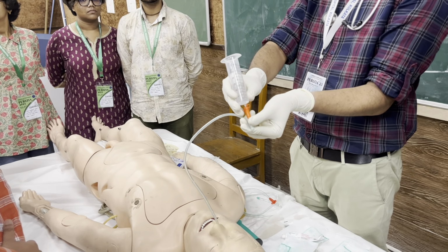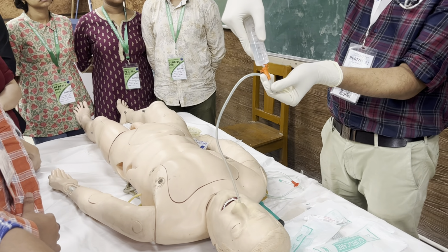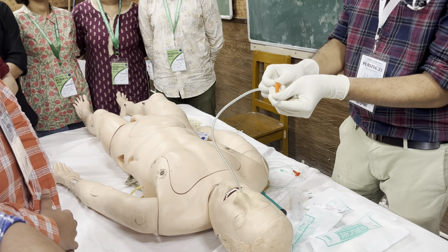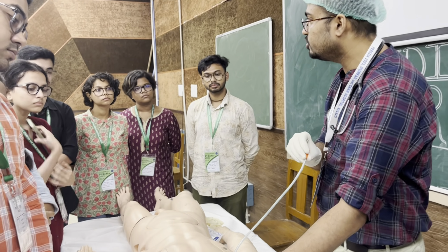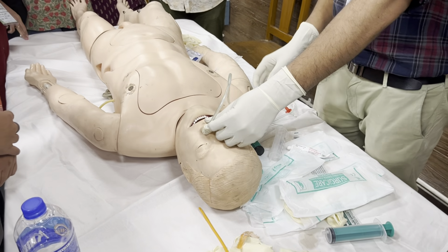And whenever you are removing, just again bend the tube. Okay. Then disconnect it. Then close the opening. Okay. And another thing I forgot, before feeding you should fix the tube in the nose with adhesive tape. Okay, fix the tube, otherwise it may come out.